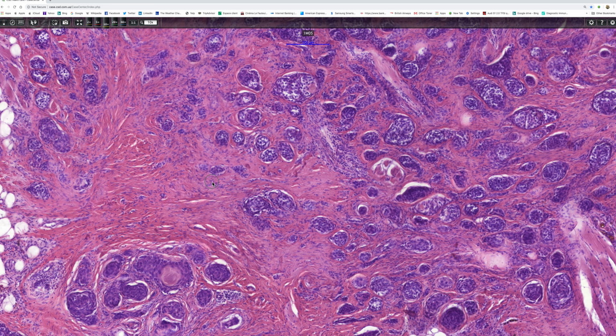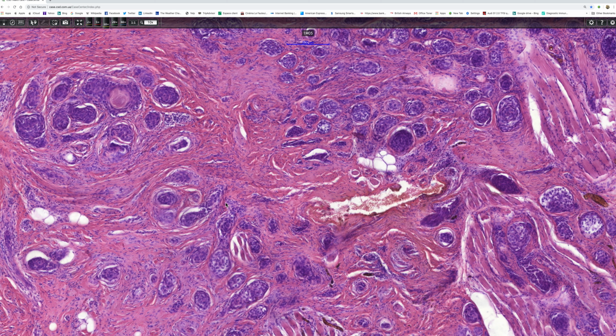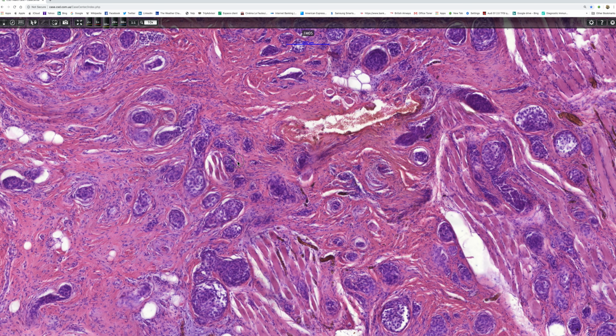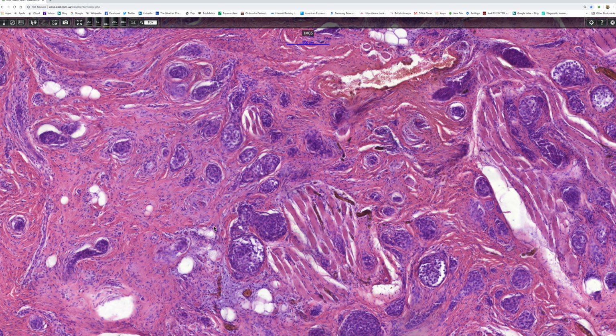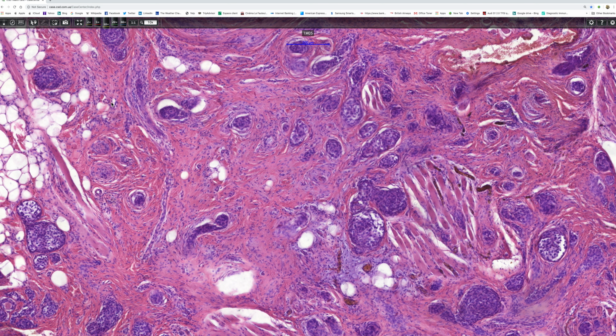Now, to give Antonina great credit, she decided she thought this was a microcystic adnexal carcinoma, and I think she's quite right, and more power to her. It was a jolly good diagnosis.